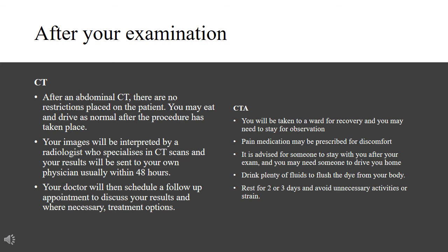You will be contacted by your doctor and a follow-up appointment will be made to discuss your results and, where necessary, treatment options. The following only apply to CTA exams. You will be taken to a ward to recover, and from here you may be allowed to go home or kept for observation. If there are any complications, you will have to stay the night.